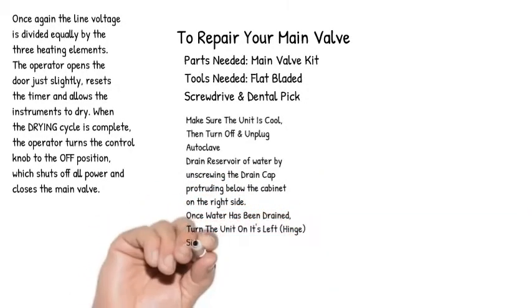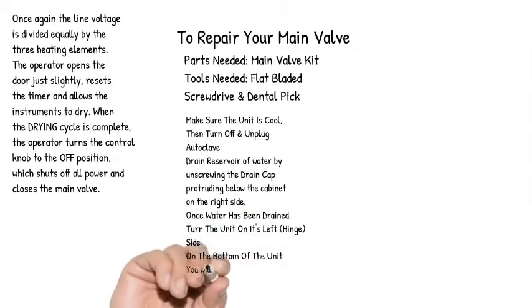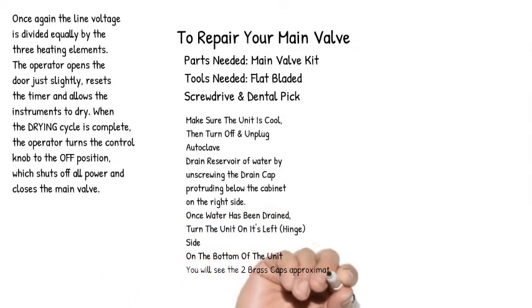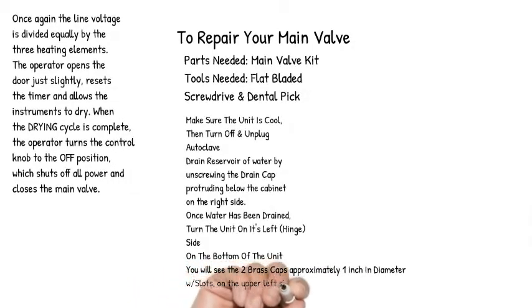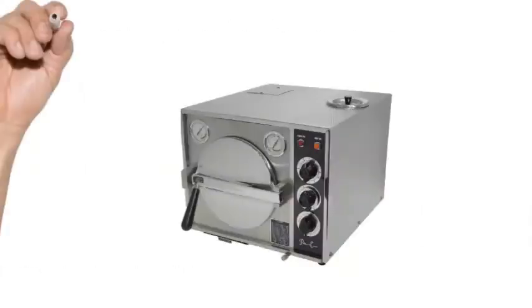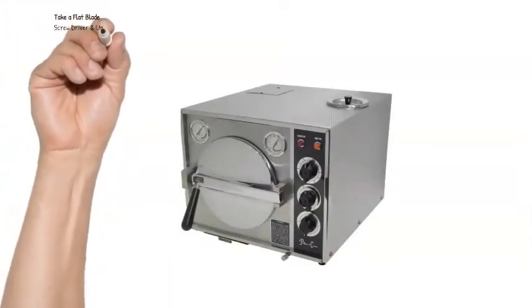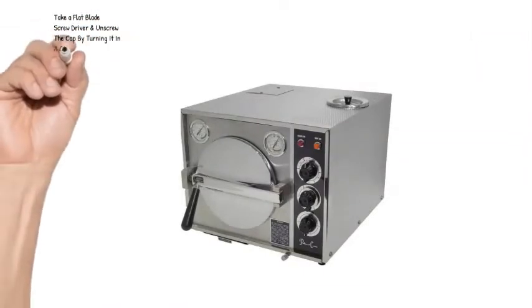turn the unit on its left hinge side. On the bottom of the unit you will see the two brass caps approximately one inch in diameter with slots, on the upper left side of the base. Take a flat blade screwdriver and unscrew the cap by turning it in a counterclockwise direction.